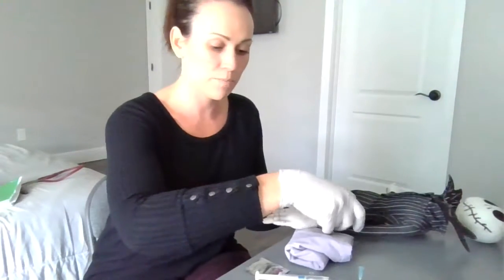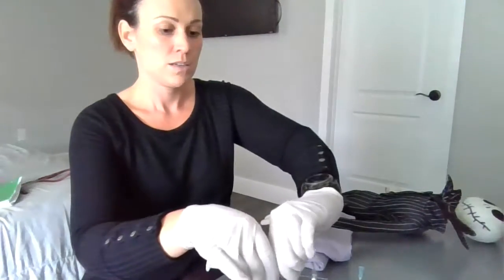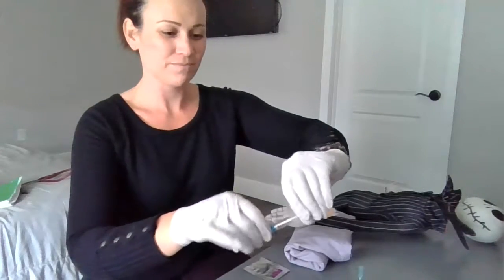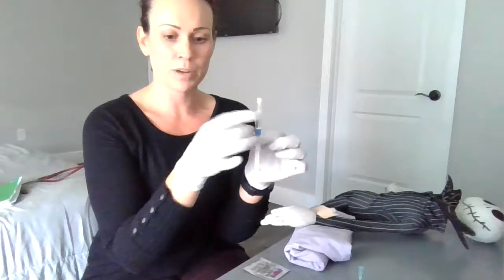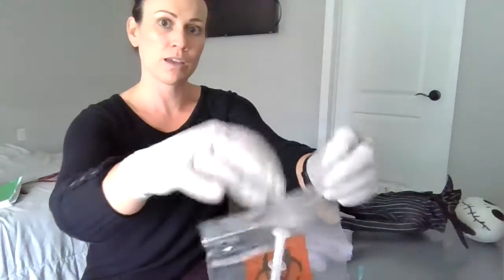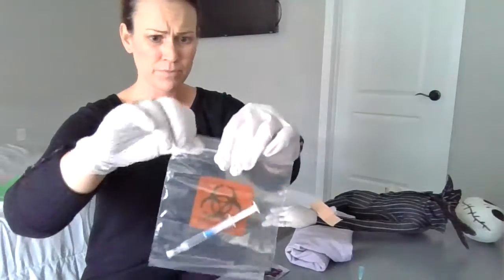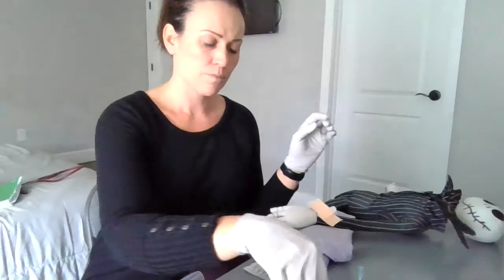I'll put a bandage on it. And now I'm going to get my sample. I'm going to cap it. I'm going to examine it, making sure that there are no air bubbles, tap it a little bit. I'll put it in my biohazard bag here, seal it nice and tight, has a label on it already. And then I'm going to get my corked needle and throw it in the sharps container.